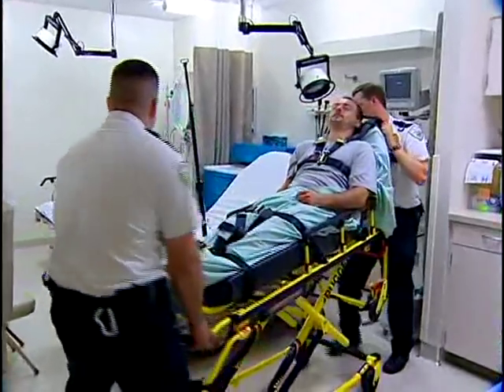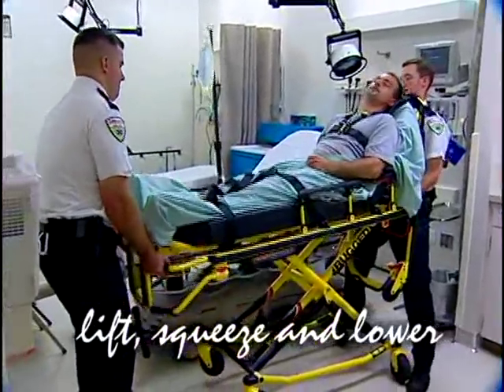The optional base lift bar can be used to steer the cot. To lower the cot, remember: lift, squeeze, and lower.